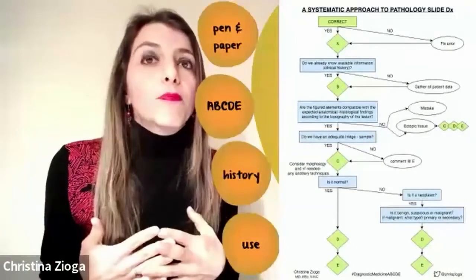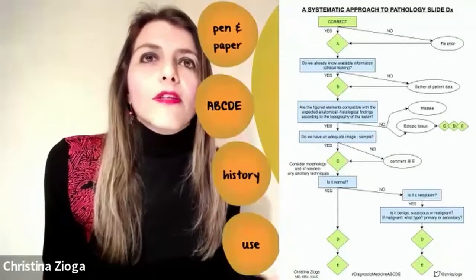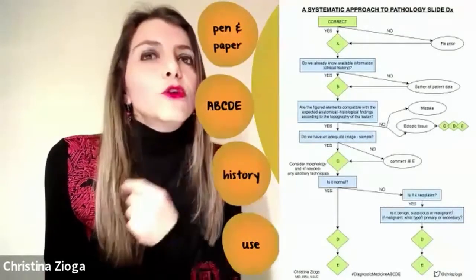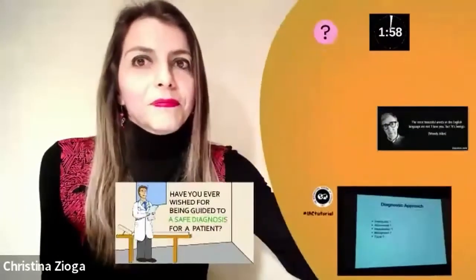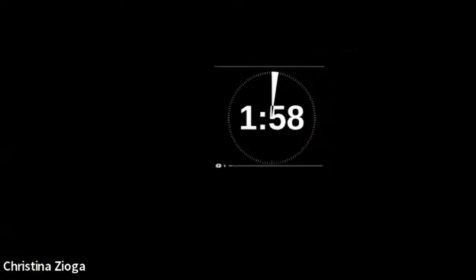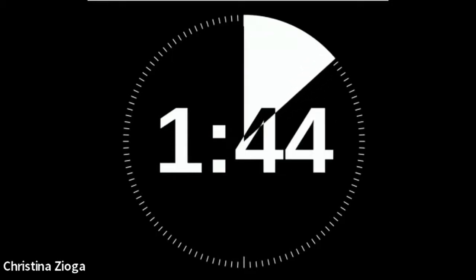Let's say you have a pleural effusion. What are the questions that come to your mind? How do you proceed to diagnosis? What is your logical thinking? What is your diagnostic approach? You have 2 minutes. Time, go. What are the questions that pop up when you have a slide to diagnose?